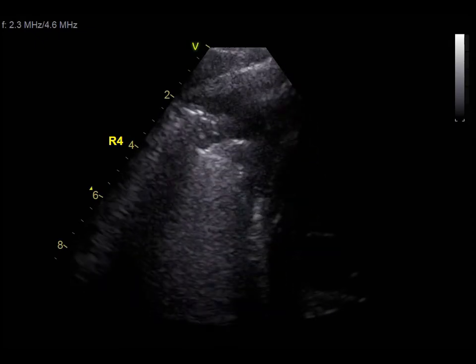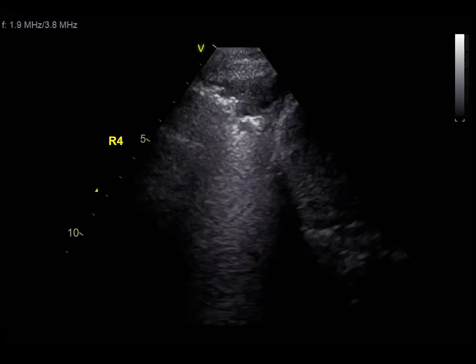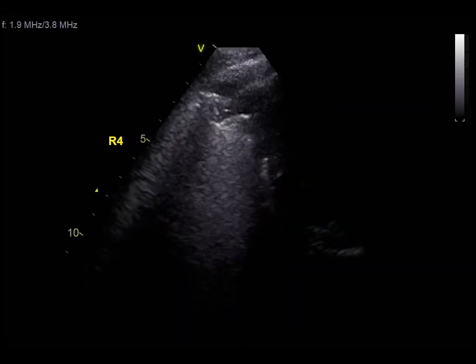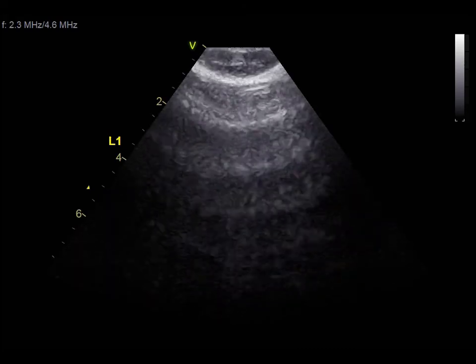And then I just took a few images. If you imagine that I had a look more from the anterior and then started to go more posterior, and then looking up and down and around and trying to see how big this area of consolidation is. It was quite significant. But I think it was again part of his chronic pattern, not new from COVID.